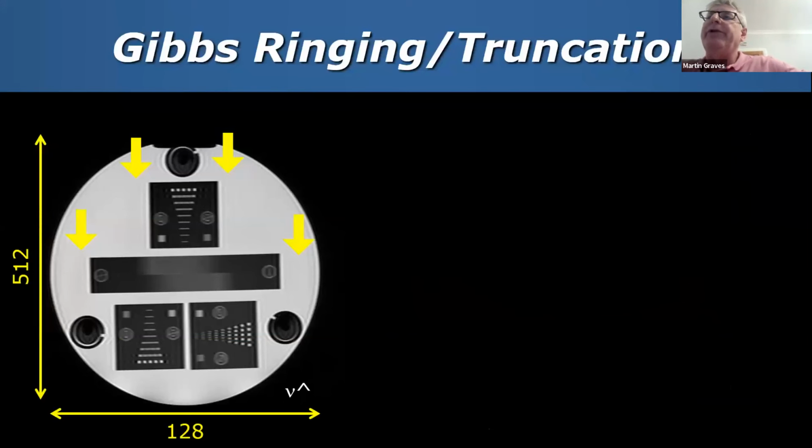One of the consequences of having that low number of phase encoding steps here is that in the phase encode direction, we get these artifacts, these parallel lines, as you can see here, which we don't really get in the frequency encoding direction because we've acquired more Fourier components or more points in that direction. And this is often known as Gibbs ringing or truncation artifacts.